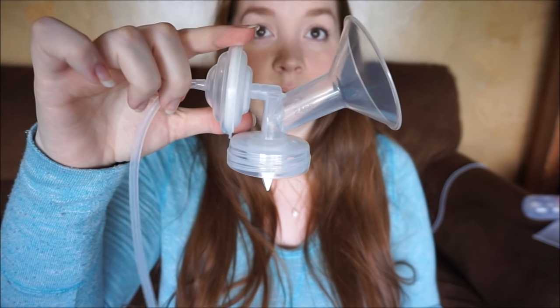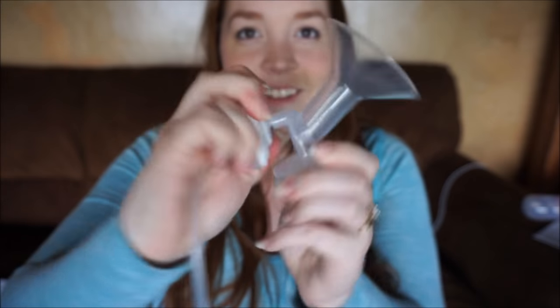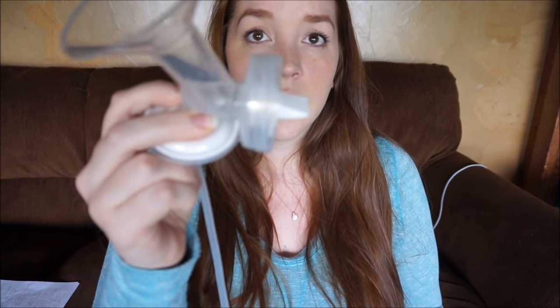It comes with two 24-millimeter flanges that slip into the back of it. It also comes with two 5-ounce bottles. It does come with a manual, which I found pretty helpful — some manuals are hard to read, but that one's pretty straightforward. There are also duckbills that it comes with.